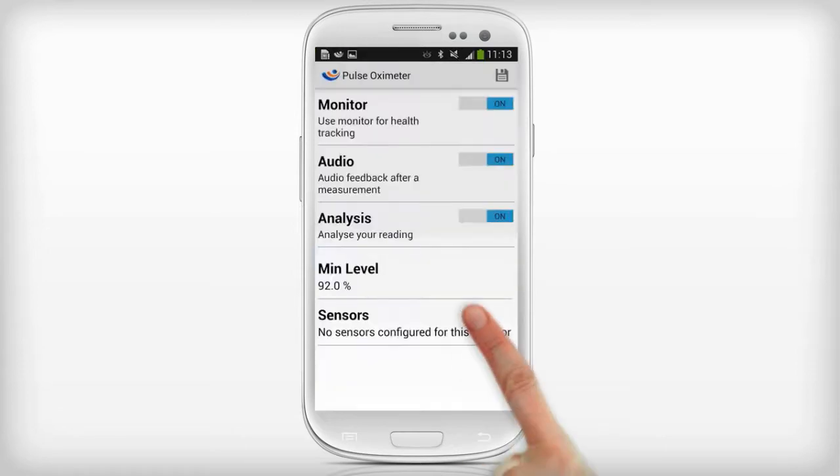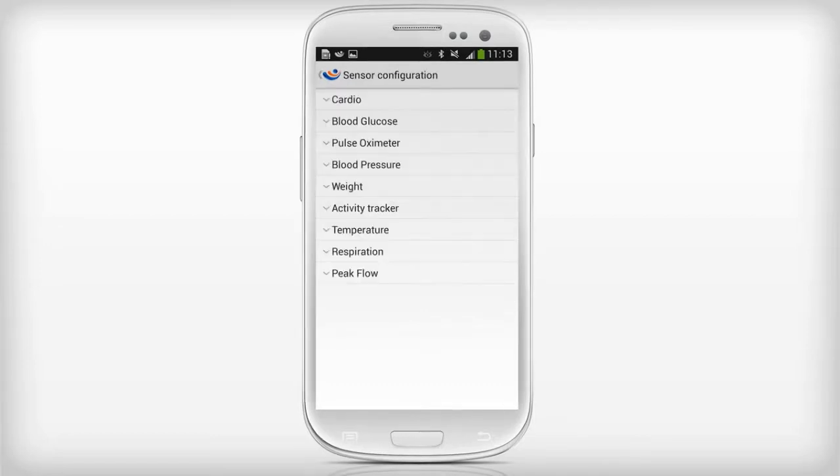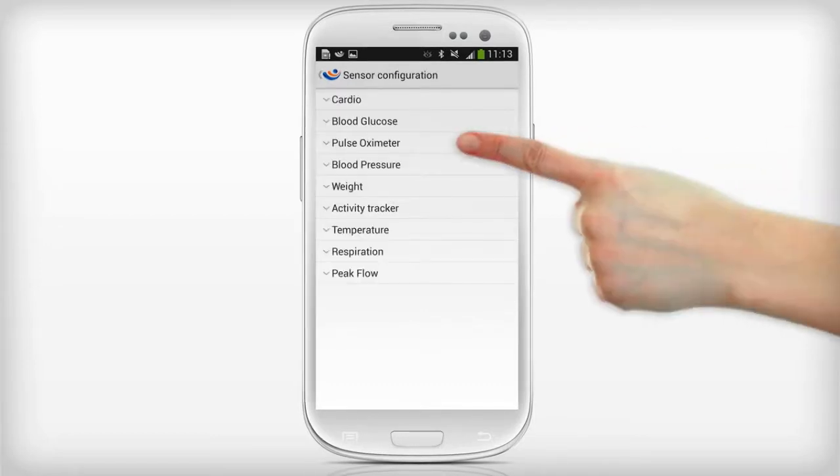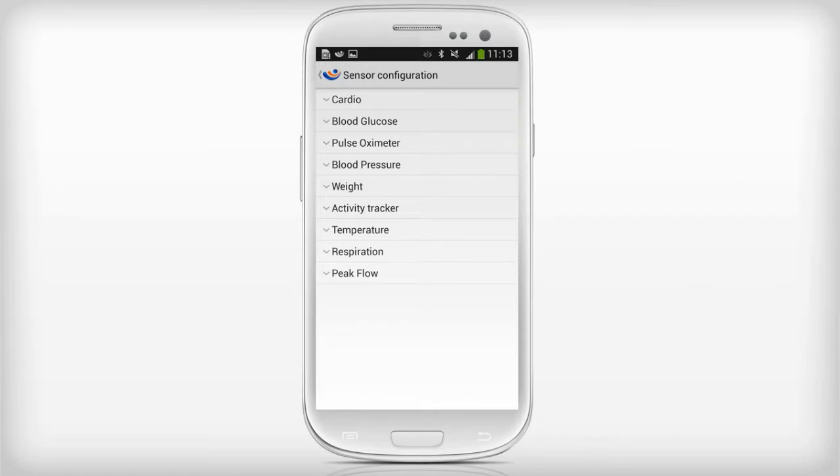Tap on sensors if you want to link a device compatible with MyFitness Companion. Click on the sensor type. Here we select the pulse oximeter.